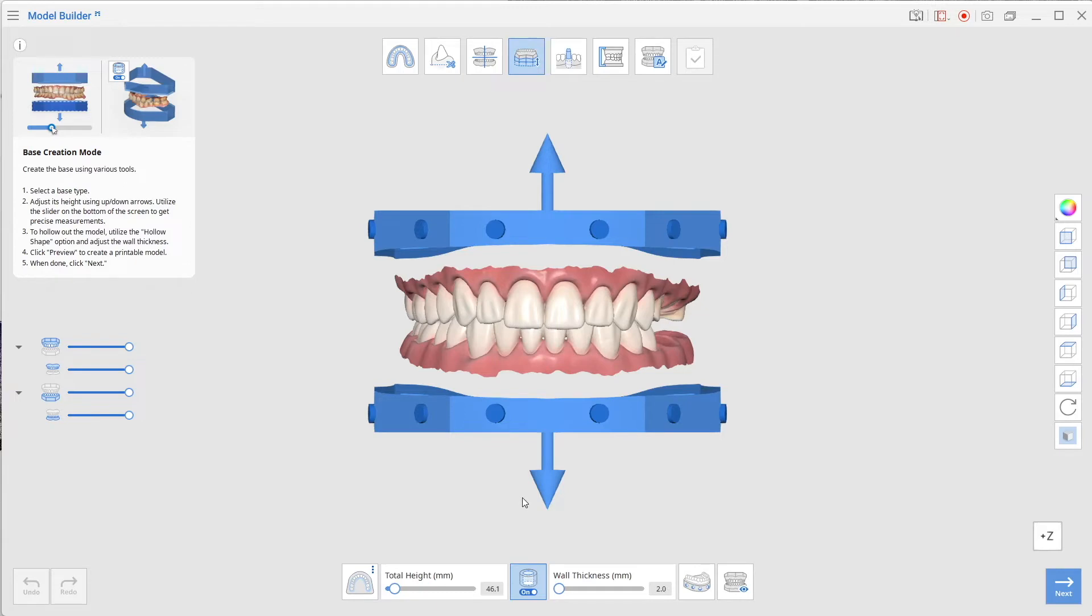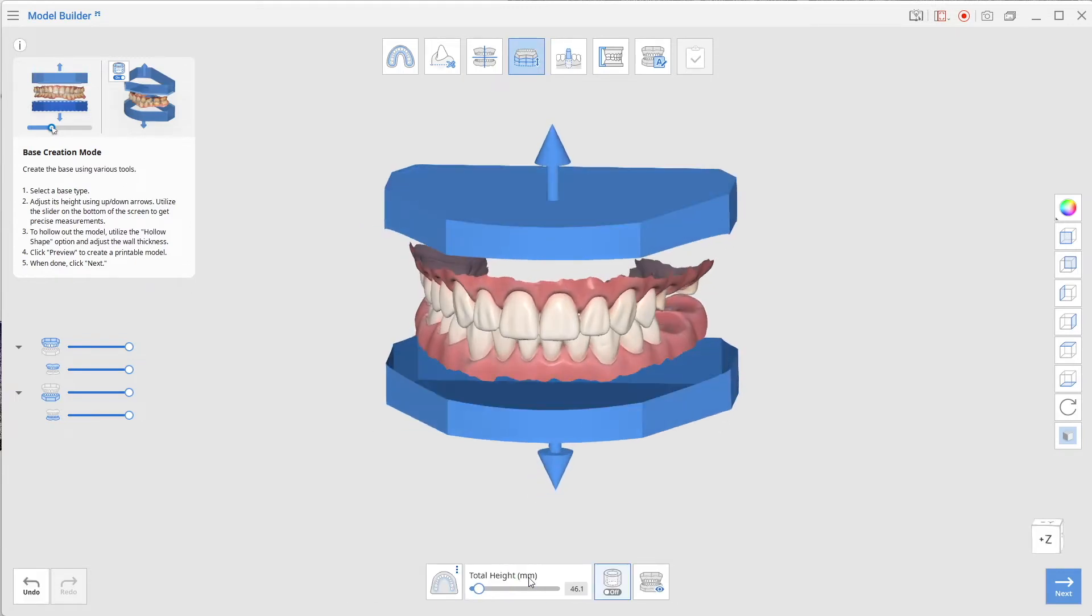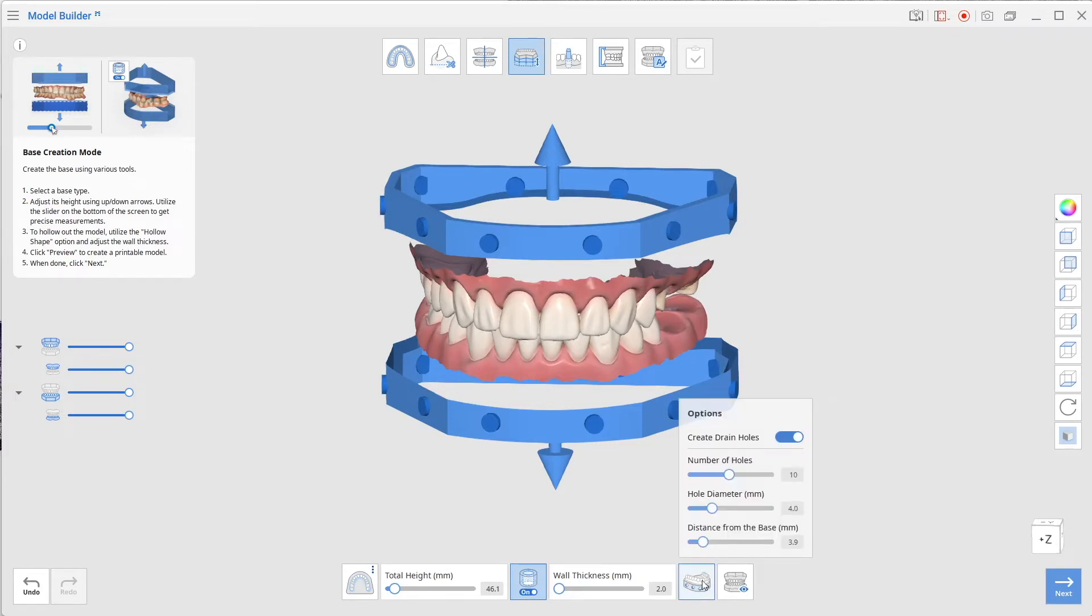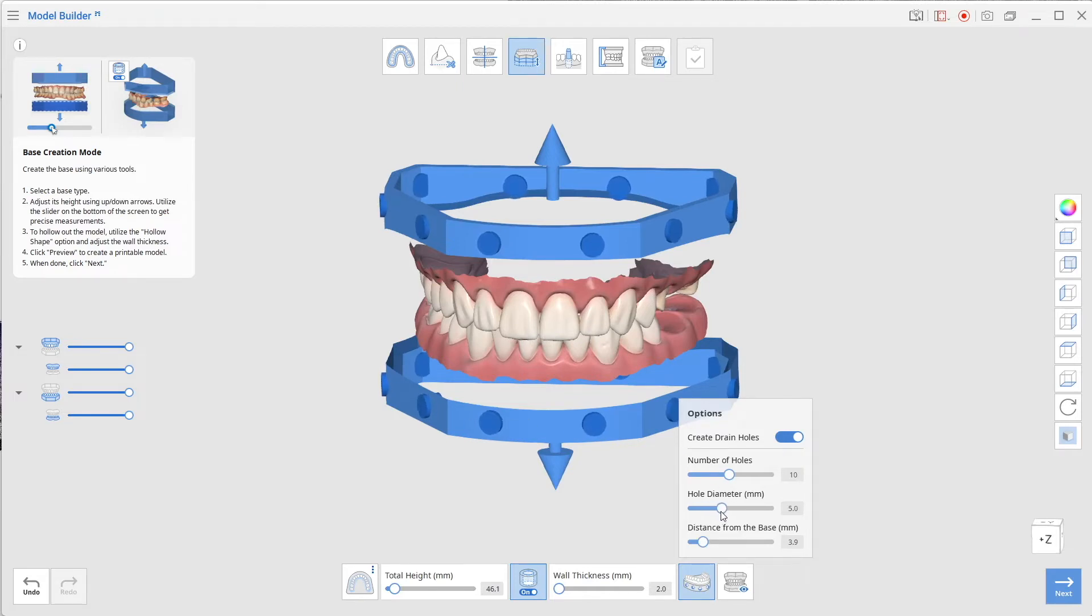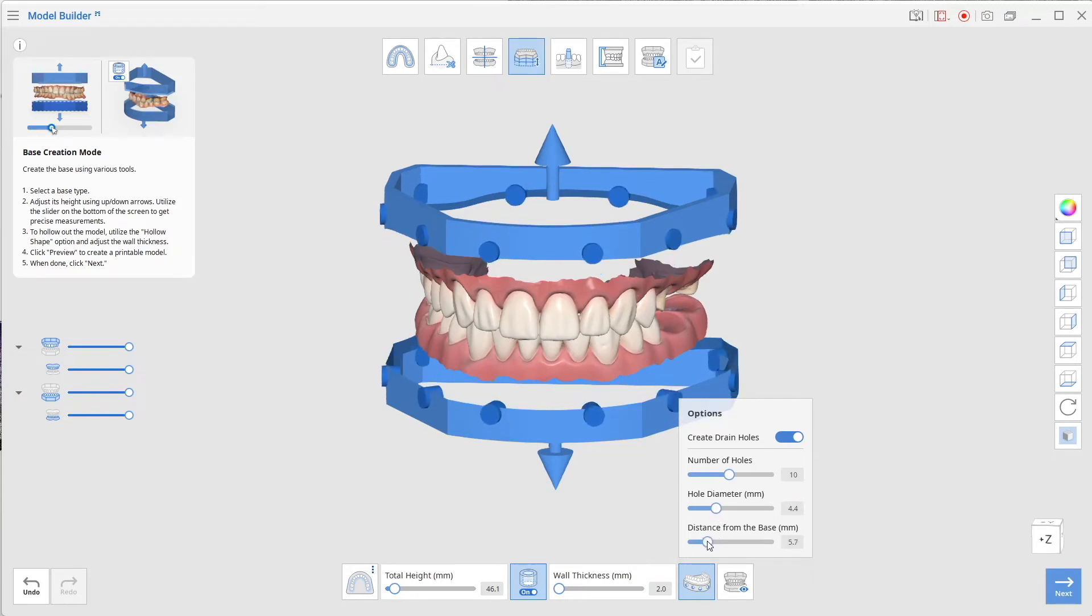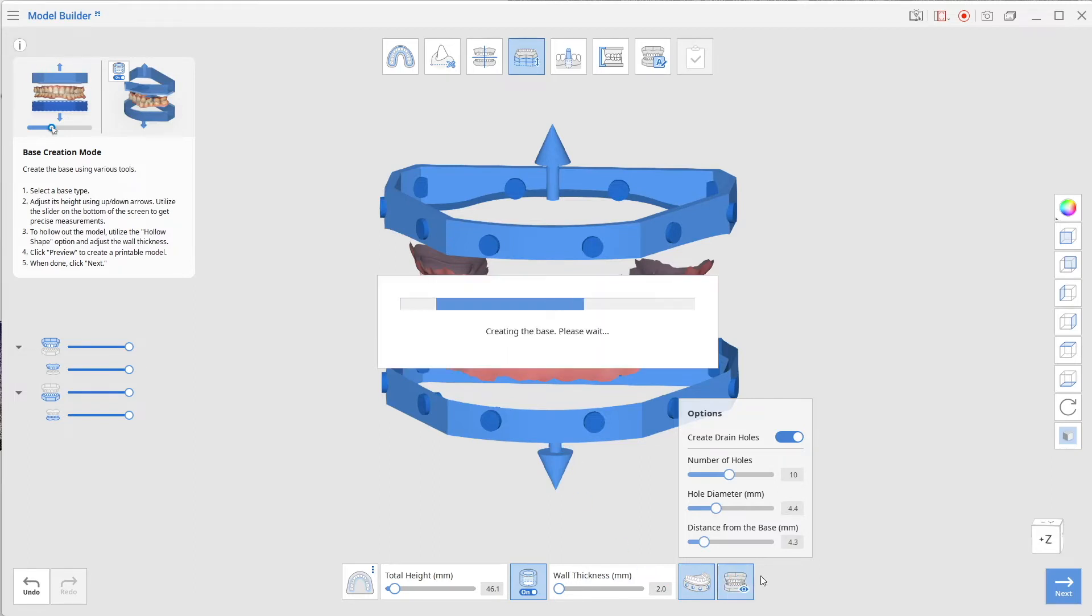Once that's done, next stage is base creation. You can see I've already gone through this so the settings are already there, but that center option here at the bottom we're going to have that on so it's hollow. Instead of it being solid it's hollow now. This icon I'm going to select create drain holes, and you can see we now got these circles which are around the side. You can increase the size of them and you can increase the distance from the base as to where those drain holes are going to be. Obviously we don't increase it too much because it's going to then impact on whatever extension of the impression that it's creating as the actual model.